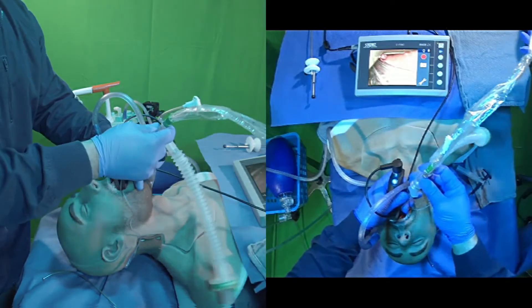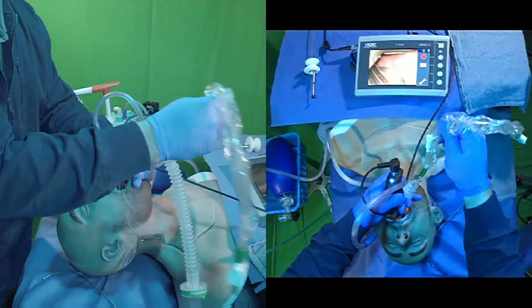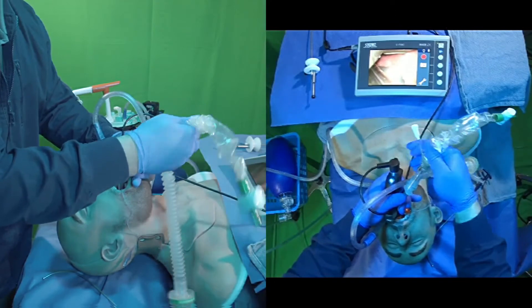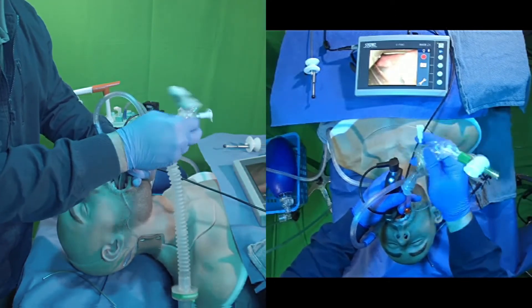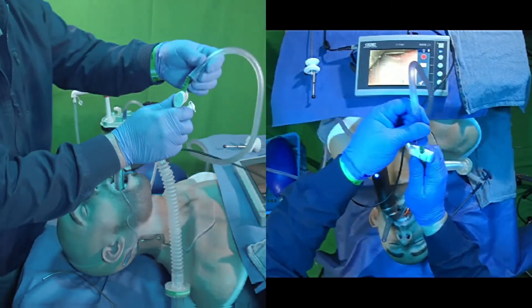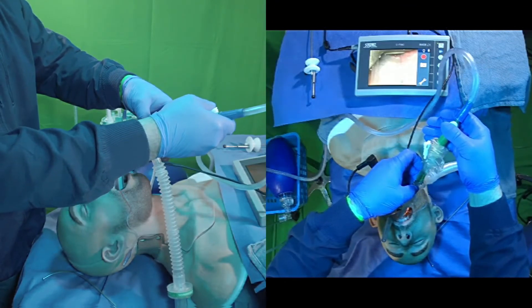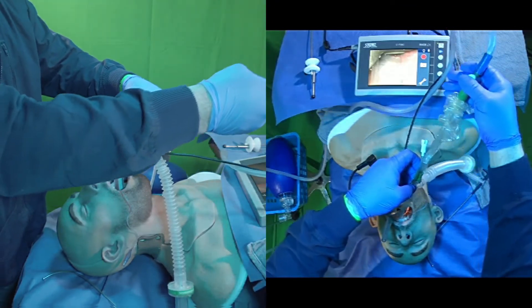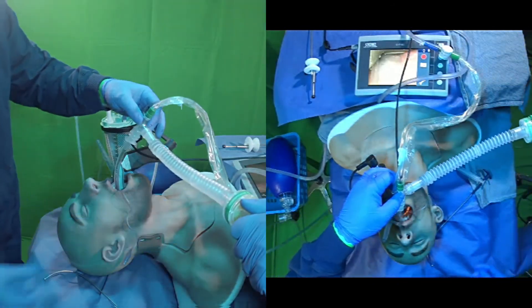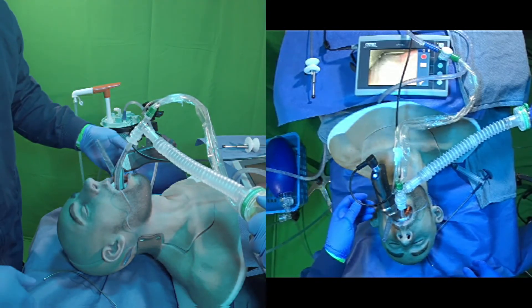So the first thing we want to do at this stage is suction out our ET tube. And as you can see, there was quite a bit of secretions and emesis inside that ET tube. Once that's clear, we can go ahead and hook up to our oxygen source and begin ventilating the patient either with BVM or through a ventilator device.